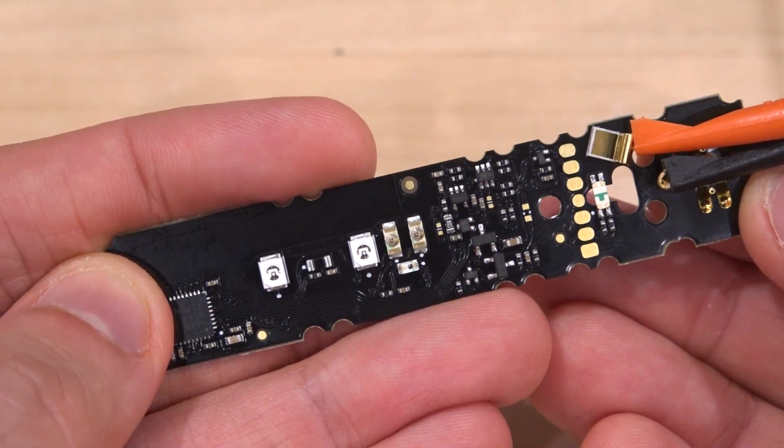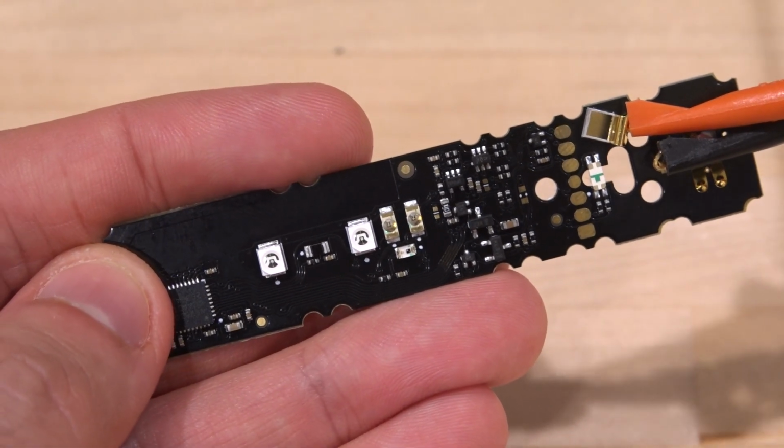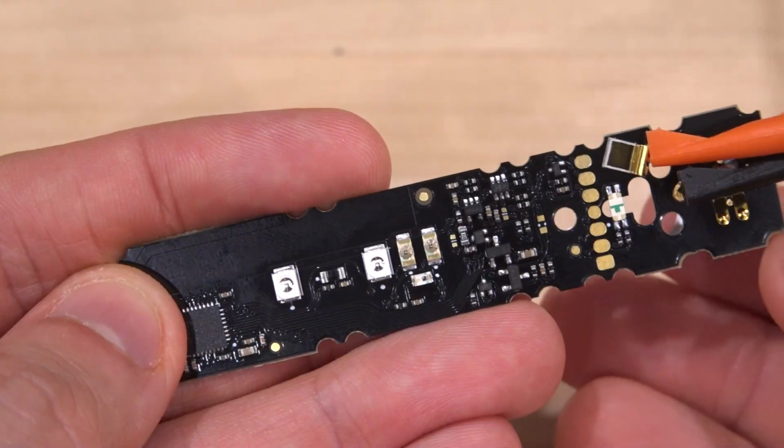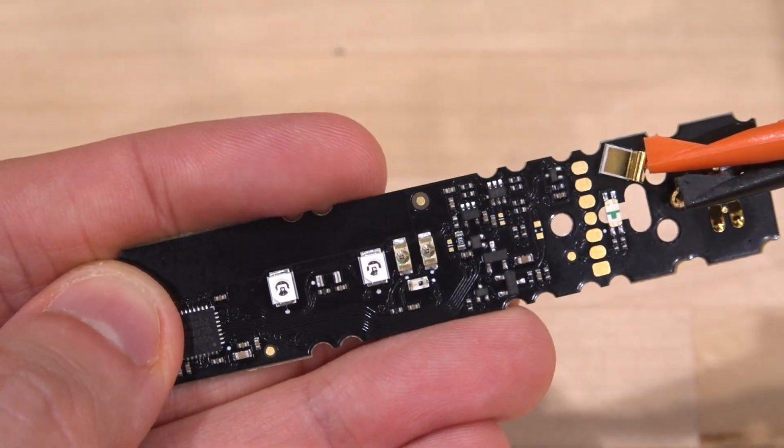Wow, look at that. That was pretty cool. Let's try that one more time. Reset the power supply. One more try so we can see the color of those LEDs again. Yeah, very neat. So we've got blue and red.